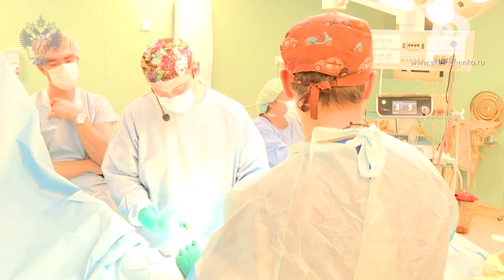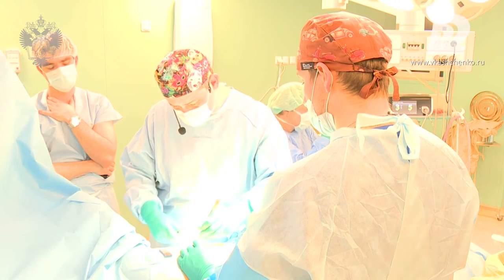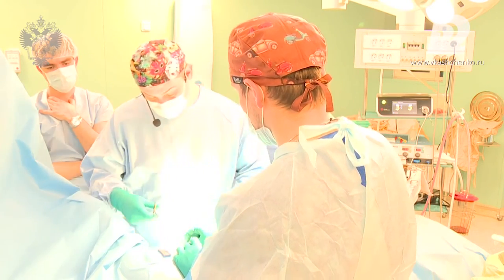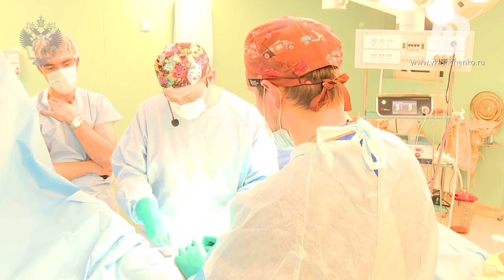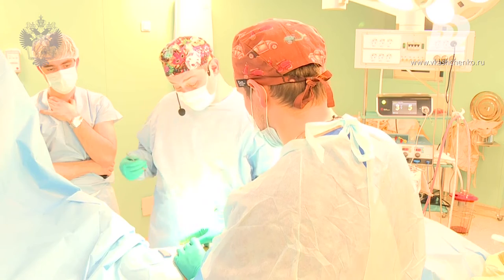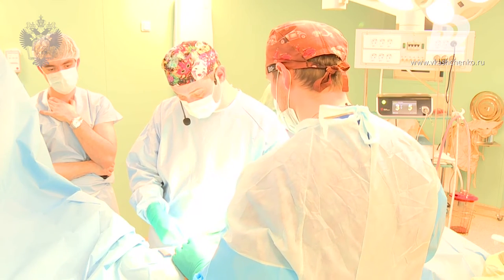And the dissection margin in this case is the nervus vagus from this particular side. Sometimes we do the dissection just like in the left lobectomy, but in this case we do not have the necessity to go under the vena cava. And probably the question came from a thoracic surgeon.